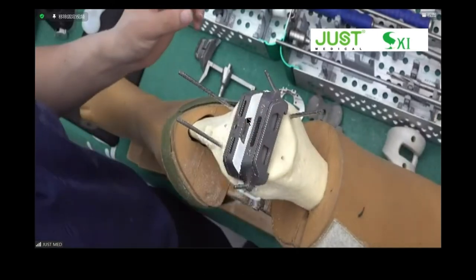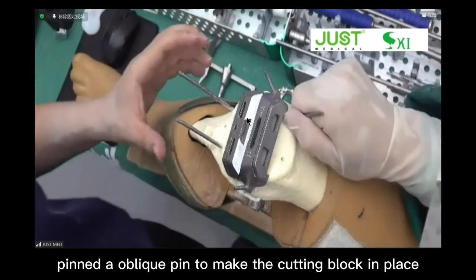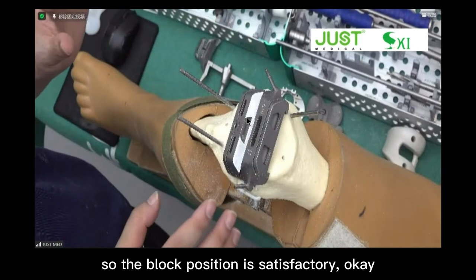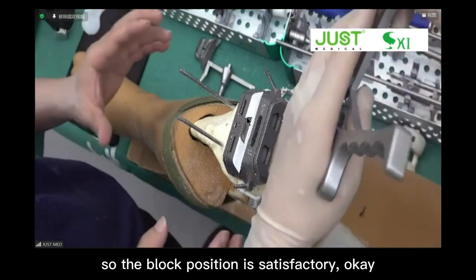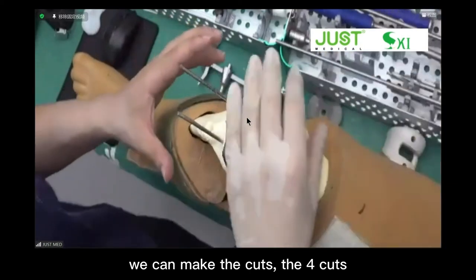Okay, we just placed the oblique pins to secure the cutting block in place. So the block position is satisfactory, okay? So we can make the cuts, the 4 cuts.